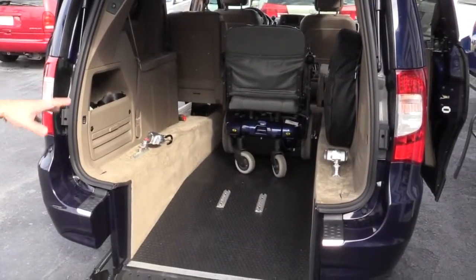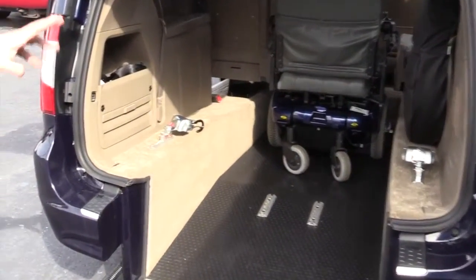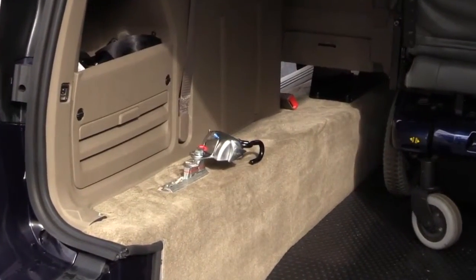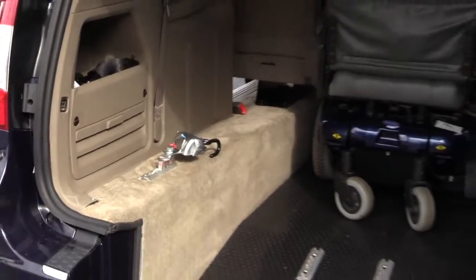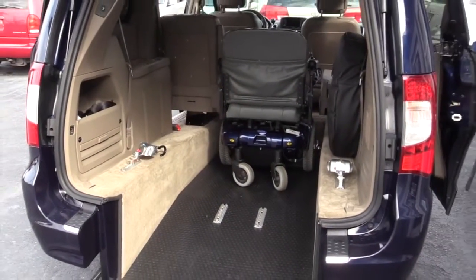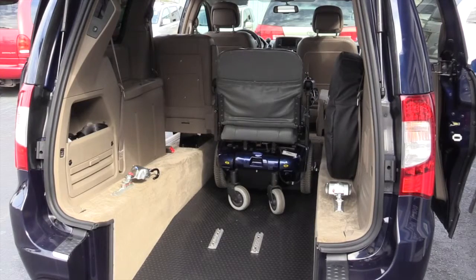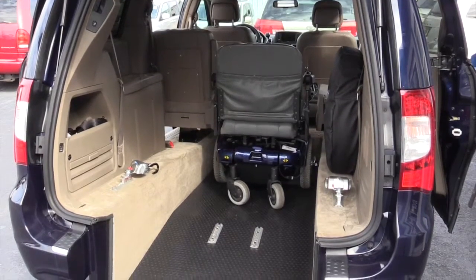The automatic retracting tie-downs have a storage space up and out of the wheelchair containment area, so they don't get in the way when you're moving the wheelchair in and out of the van. Once your wheelchair is in the vehicle, you can relocate the retracting tie-downs to the appropriate place to lock the wheelchair down.